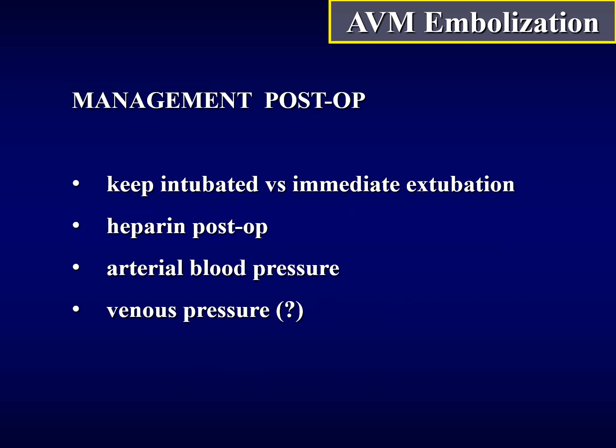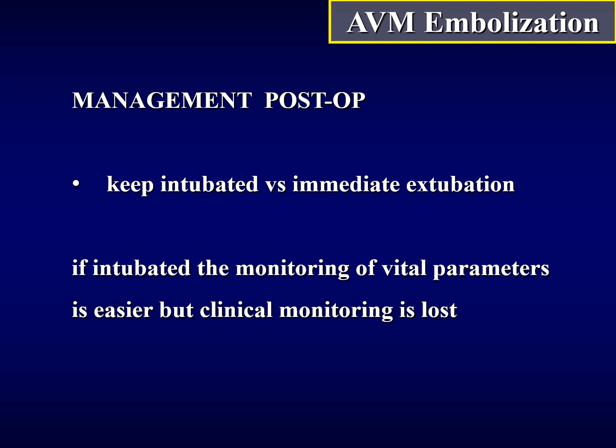We may finish with a few considerations about the management post-embolization, about these topics that you see here. So the question is, should we keep intubated or have an immediate extubation? Of course, if you keep the patient intubated, the monitoring of vital parameters is easier, but the clinical monitoring is lost.